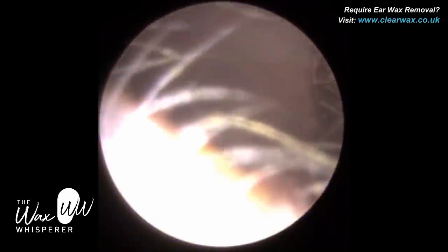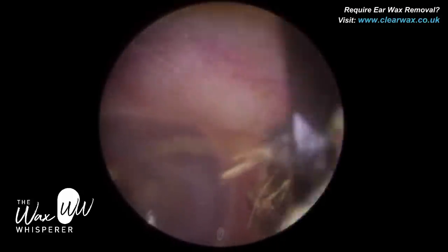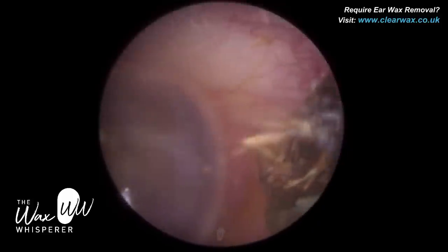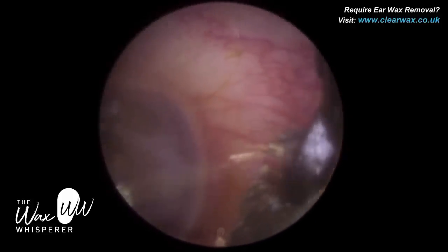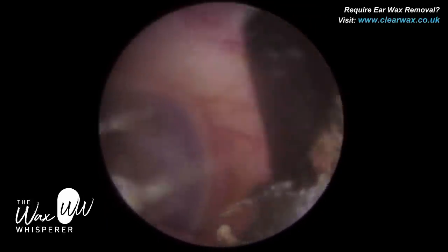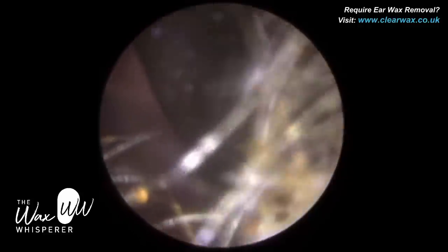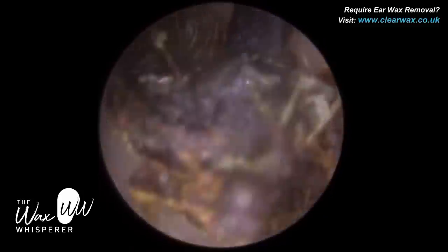You can see the majority of the eardrum there. This wax is extending probably halfway into the ear canal, and some of it where I am now is on the bony portion. The outer third of the ear canal is cartilaginous — it's semi-flexible, semi-sensitive, and we can apply some pressure there. But on the bony part, we have to be very careful because it's just a very thin layer of skin adhered to the bone that makes up the ear canal.